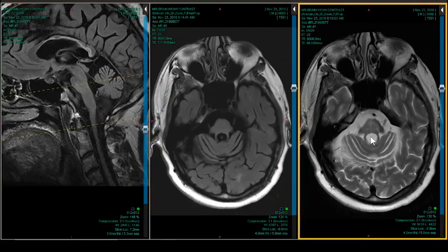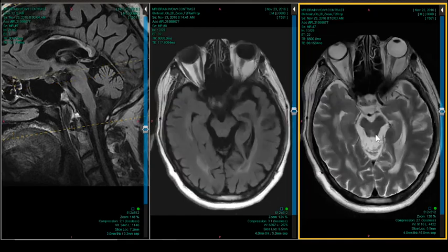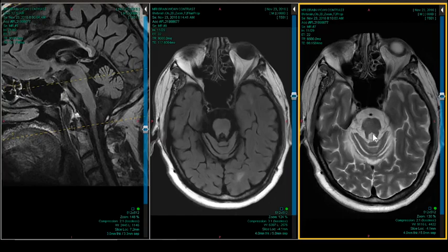But looking for these signs, and looking for the predominance, where is the atrophy, will allow you to prioritize. Yeah, there's vascular disease, but I don't think that's the problem. Vascular disease is not going to give you this pattern of atrophy. Try to categorize it, depending on the history you get, it can help get you on the right track. But this one, you can see this is wide open. It's not quite a molar tooth like you would see in Joubert's syndrome, but it kind of looks like that.